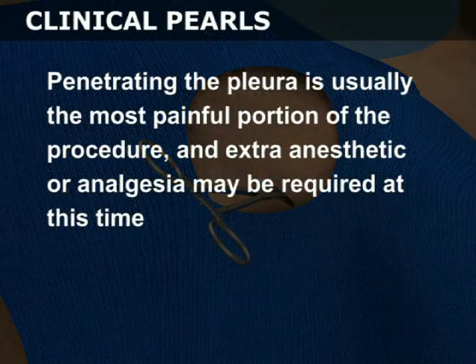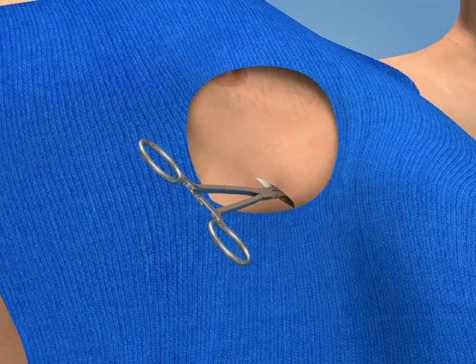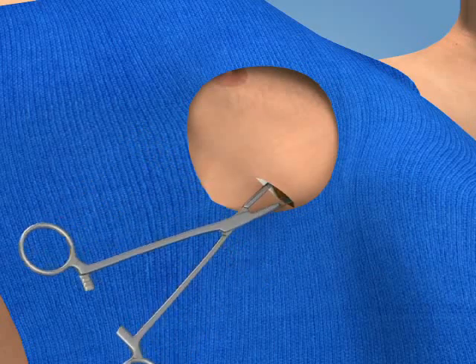Continue to apply firm pressure and advance the Kelly clamp through the pleura and into the thoracic cavity. Penetrating the pleura is usually the most painful portion of the procedure and extra anesthetic or analgesia may be required at this time. To avoid penetrating too deeply, hold the Kelly clamp several centimeters from the incision site prior to puncturing the pleura. With the clamp tip in the pleural cavity, spread the clamp widely and withdraw it to make an adequate entry portal.